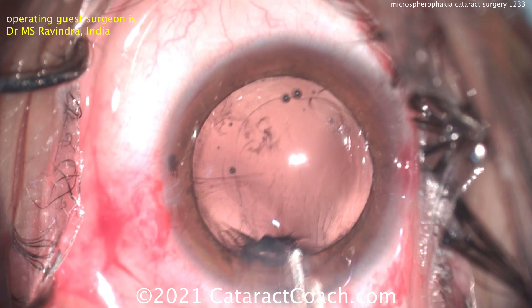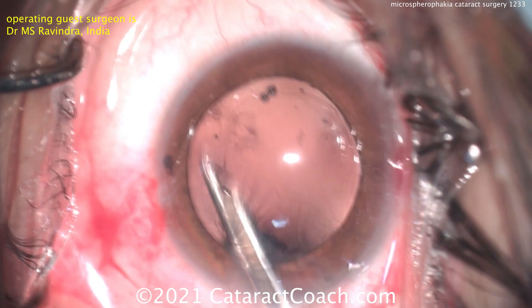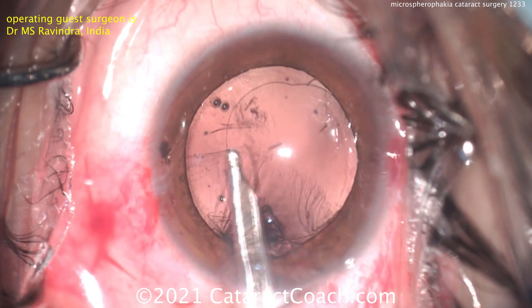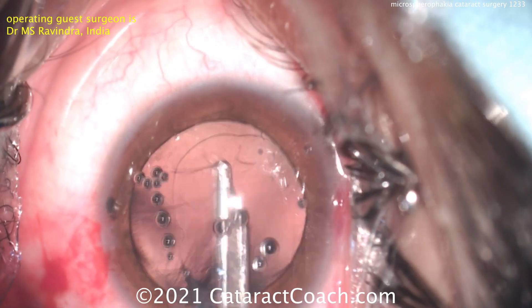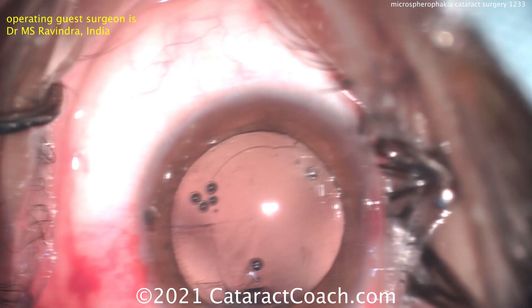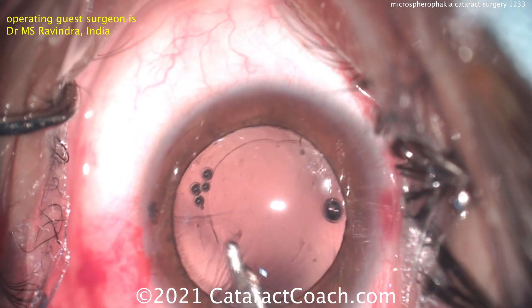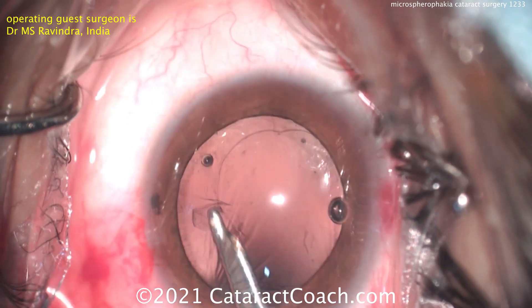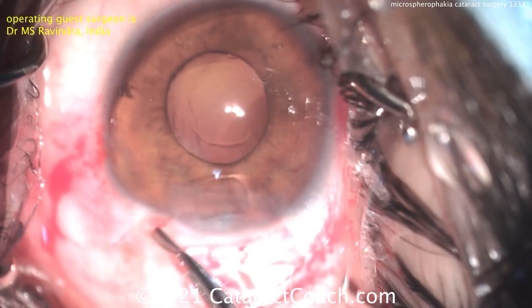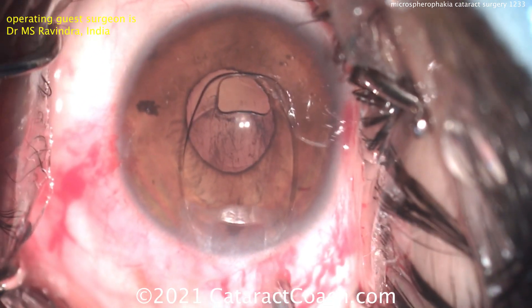Again, there's going to be very weak capsular support here. The zonules are very, very weak, and you can see how that capsule just wants to wrinkle up so much. So if you do place a lens in the capsule bag, you're going to need a lot more maneuvers — perhaps capsular tension segments sutured in place.